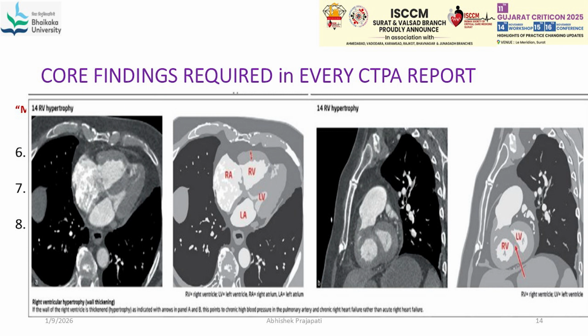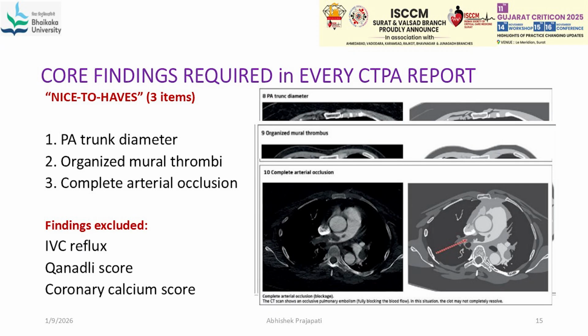Bronchial artery dilatation: these are the bronchial arteries. The lungs themselves get their nutrition and oxygen via the bronchial artery, not the pulmonary artery, which I also came to know by reading this article. Because of that, when the blood clots remain in the vessel for a longer duration, this bronchial artery gets dilated. This is a sign of chronic PE and not the acute one.